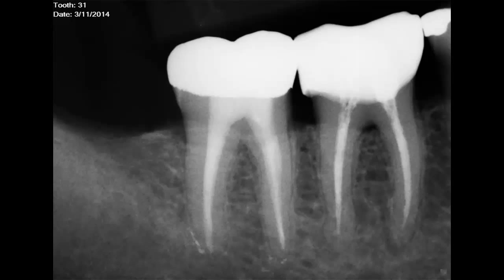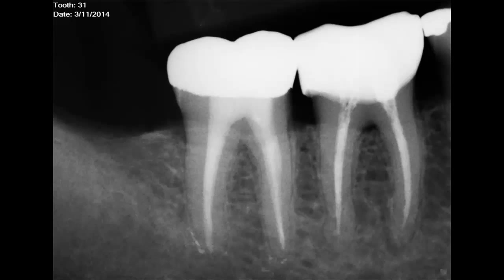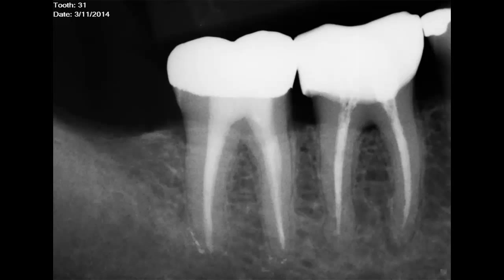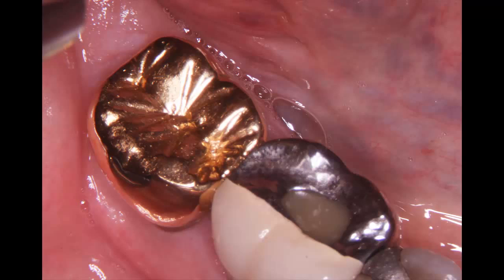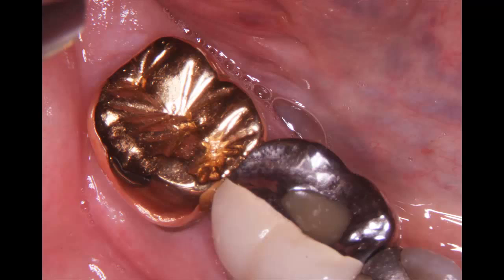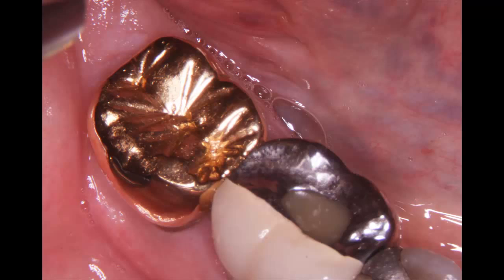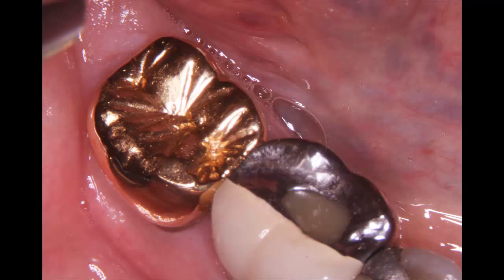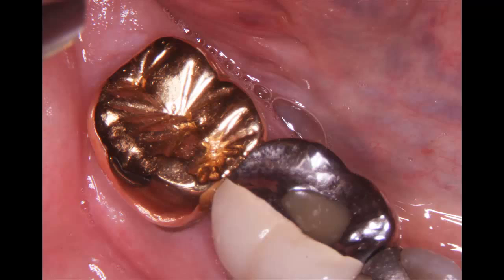The adjacent first molar shows furcation bone loss and a small periapical radiolucency about the mesial root. The clinical microphotograph shows the nice gold crown restoration of the mandibular second molar and the porcelain-fused-to-metal crown on the first molar with a very small occlusal outline. Very small occlusal outlines limit your ability to evacuate debris and irrigate, limiting thorough cleaning of the canal system.